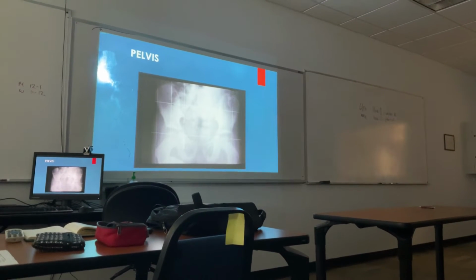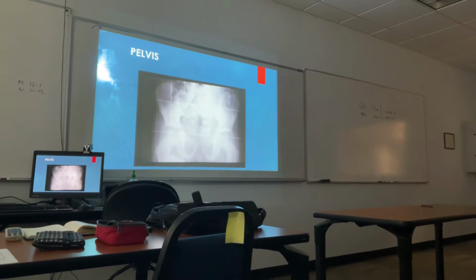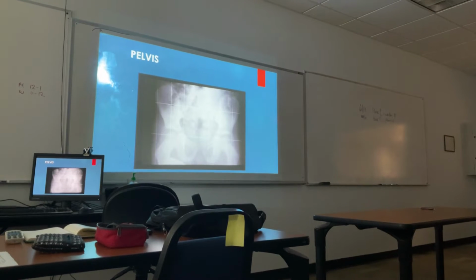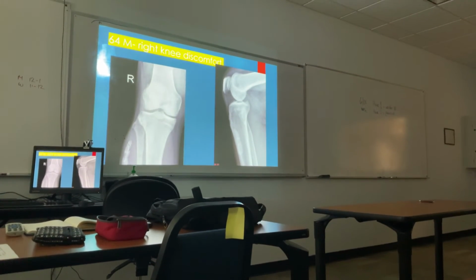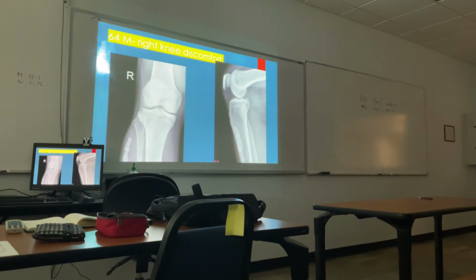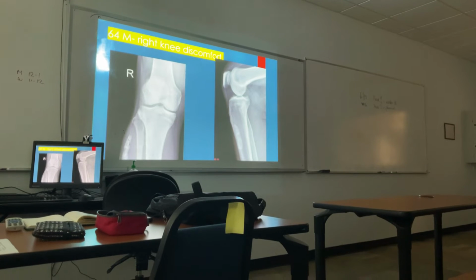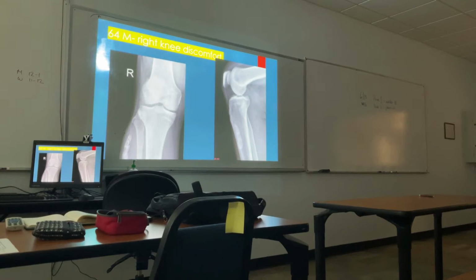We know the pelvis exam doesn't need gonadal shielding, right? That's right. So which is worse, not to have the gonadal shielding or put it in the wrong place? Both. Yes, right? Put it in the wrong place, then you can see. Okay, just to show you. Soft tissue calcification where there shouldn't be calcification.